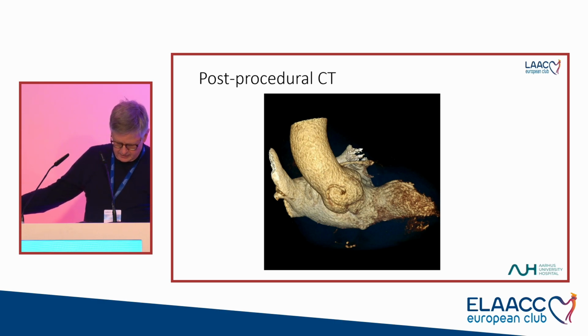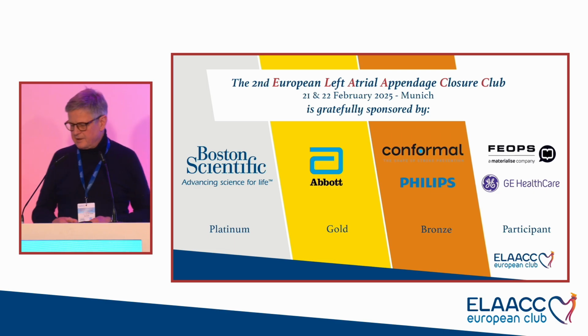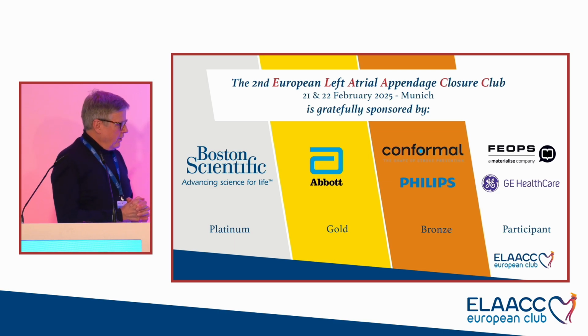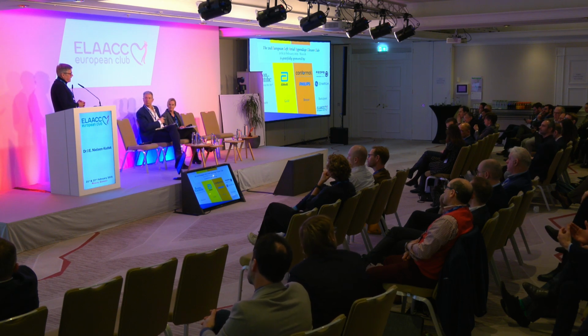Maybe you can go one forward. No, I missed the last slide, but anyhow, it looks on 3D CT follow-up. We have done 10 implants so far, and it looks like we get very, very nice sealing with this device so far. Thank you.